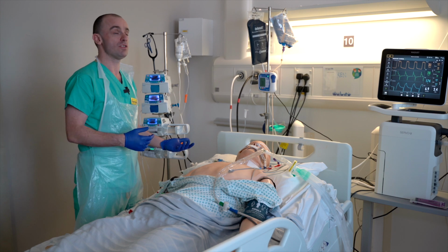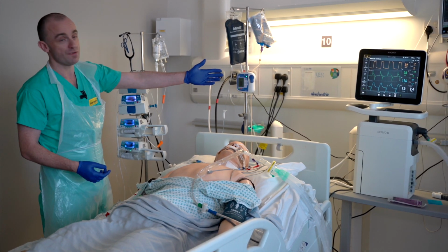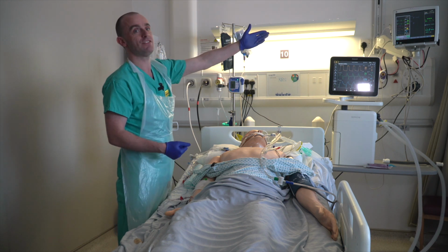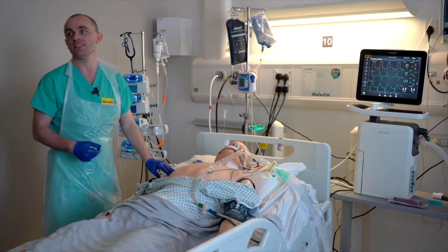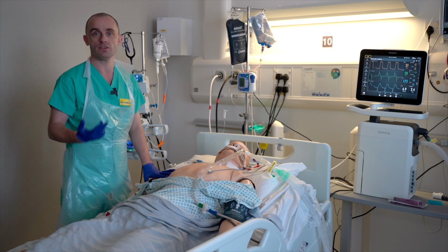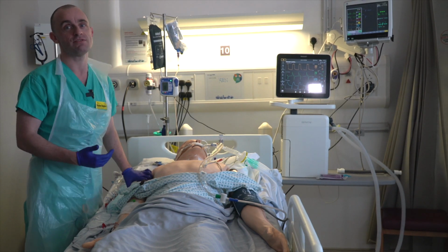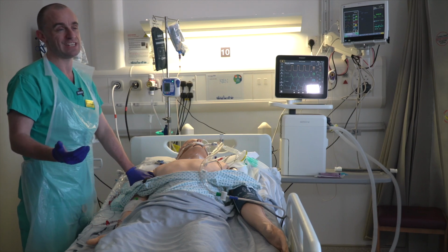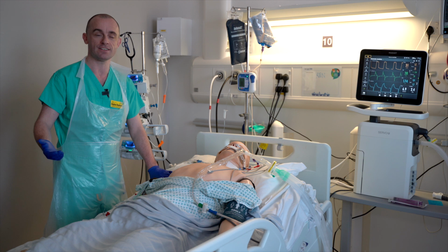I can also start and look at the ventilator, and I can see here that this patient is on 50% oxygen. I can see, looking at the monitor, that that's giving me sats of 96%. And I can also see, looking at the screen, that this patient's on a pressure control mode. I can also see what tidal volume they're getting. Again, you're not expected to understand these values, but you're able to get a sense of how much oxygen the patient's needing, and then by liaising with your nursing colleagues, what the trend is of that.